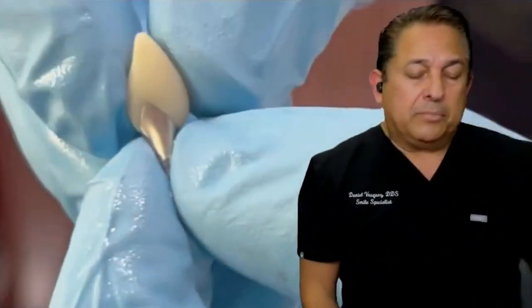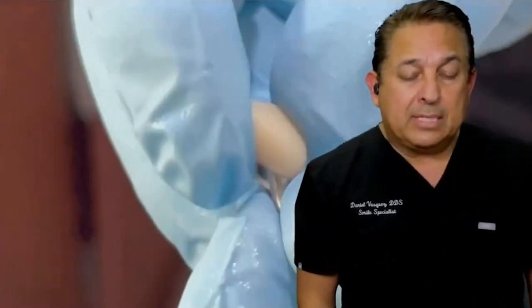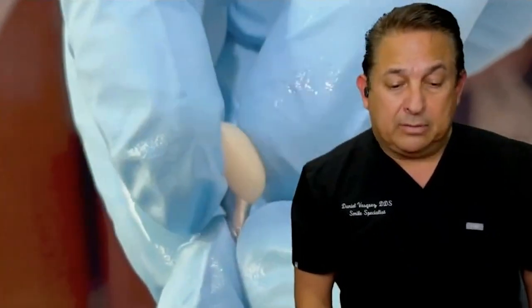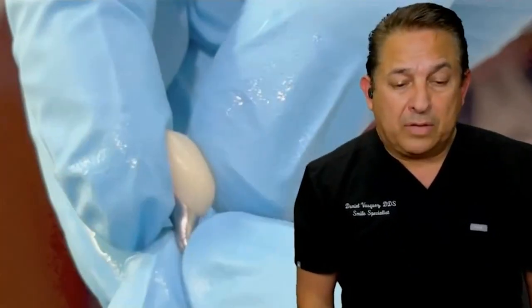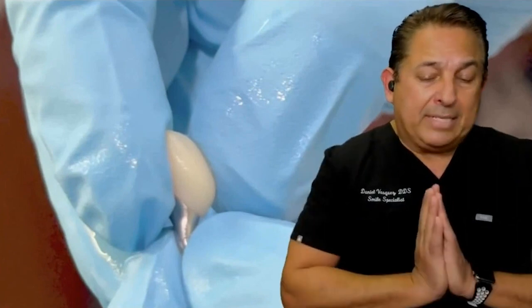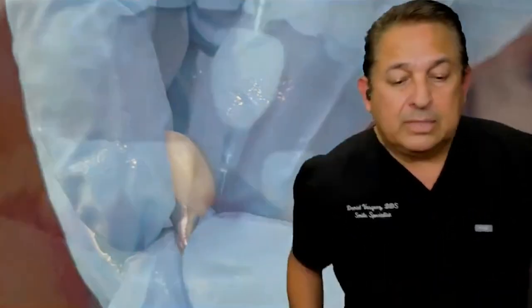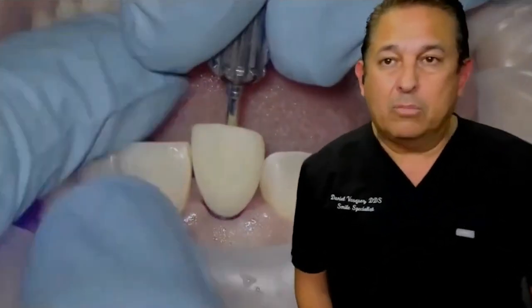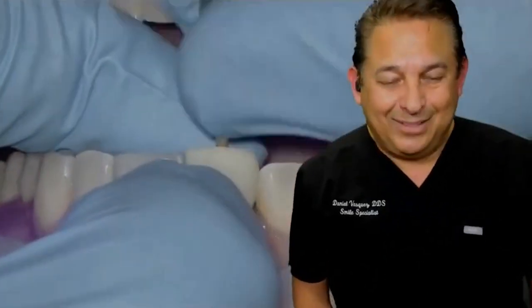So this is the permanent abutment done already, and I printed the temporary crown. So both pieces, they're already done. So let's try this in the patient's mouth, okay? Check this out. Look at that.